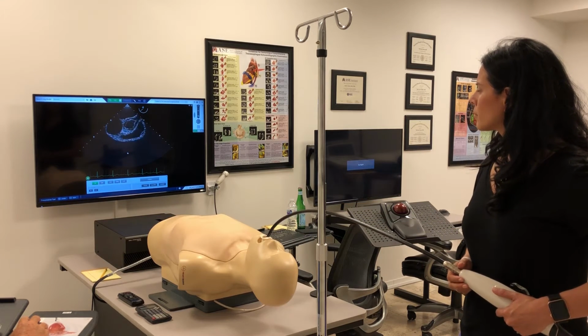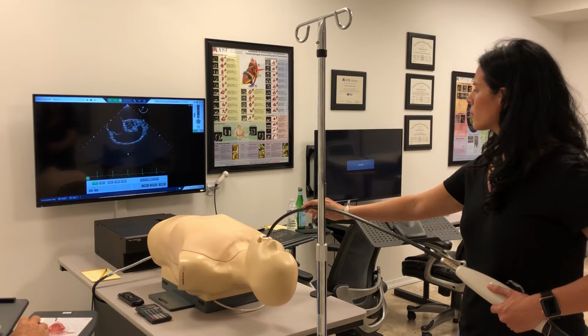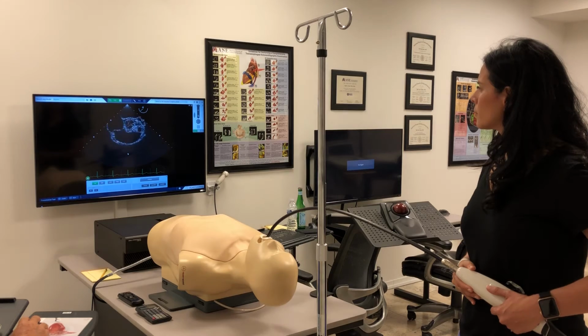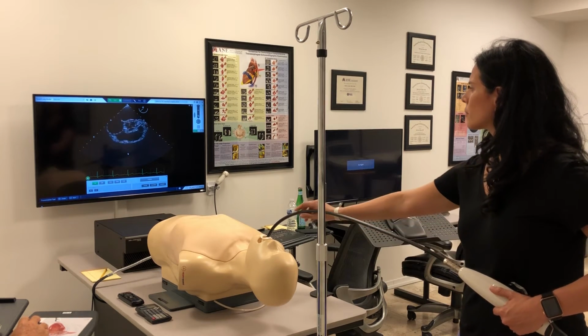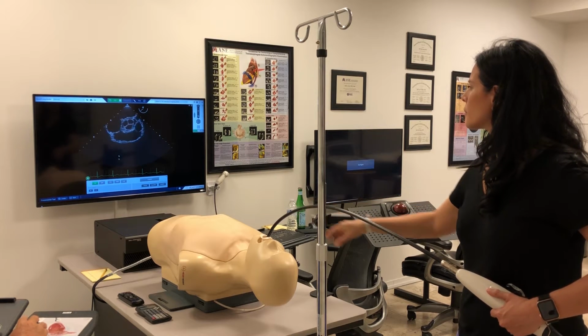But let's just demonstrate going below the valve a little bit by inserting the probe a little bit. Good. Now you're down in the LVOT. So if you saw this view, you'd have to withdraw a little bit out of the LVOT back up to the coaptation level. So let's go ahead and do that. Notice that this is an excellent view to look at the interatrial septum.